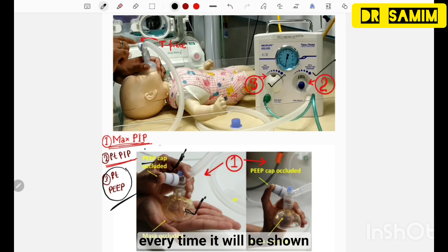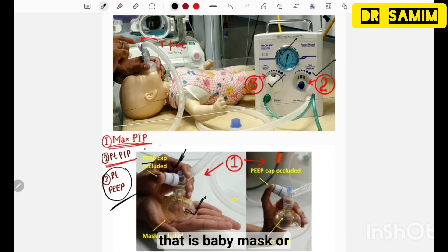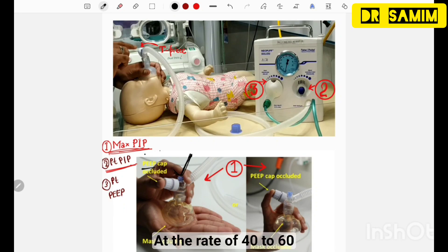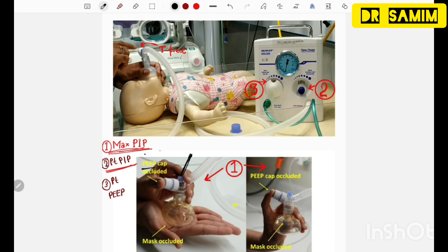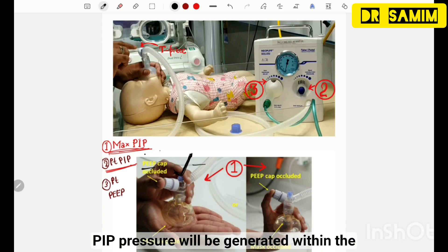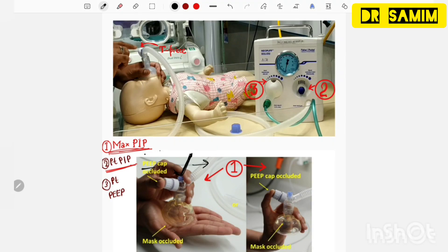When adjusting any pressure, the reading will be shown on the pressure dial. After attaching the patient interface — baby mask or ET tube — to the baby, intermittently occlude the PEEP cap at a rate of 40 to 60 breaths per minute, just like giving breaths to the baby. When the PEEP cap is occluded, PIP pressure is generated; when released, PEEP pressure is generated. The T-piece resuscitator can be used in the delivery room for neonatal resuscitation or as transport ventilation when moving the baby from the delivery room to the NICU.